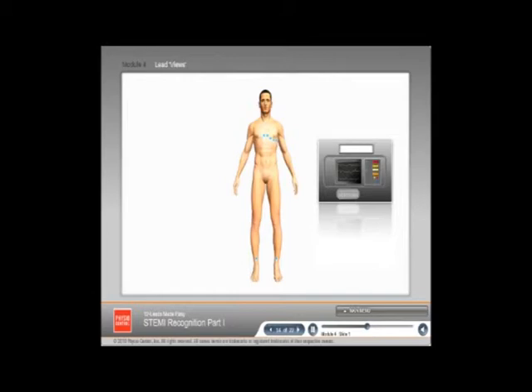However, we are not going to go into a lot of detail about those differences between leads. Instead, we're going to concentrate on one important similarity that all leads have in common. Each lead has one and only one positive electrode. That positive electrode functions as a camera or an eye for that lead. The location of the positive electrode on the patient's body determines which part of the heart that lead sees. So let's go lead by lead, think about the location of the positive electrode, and consider which part of the left ventricle we would see from that vantage point.